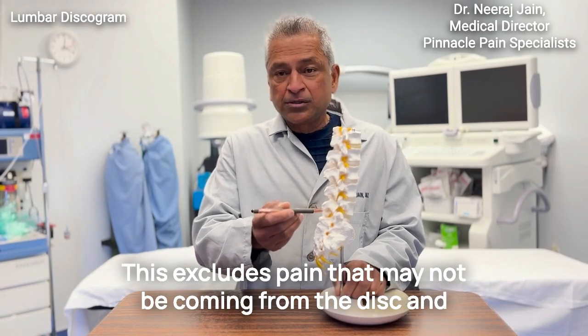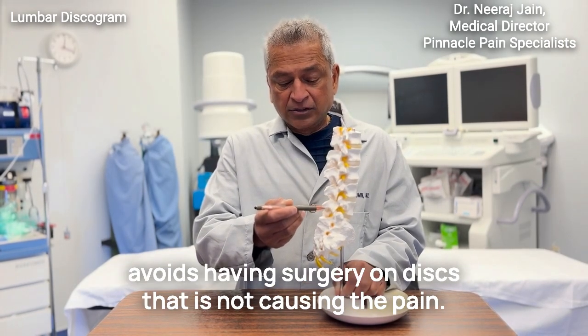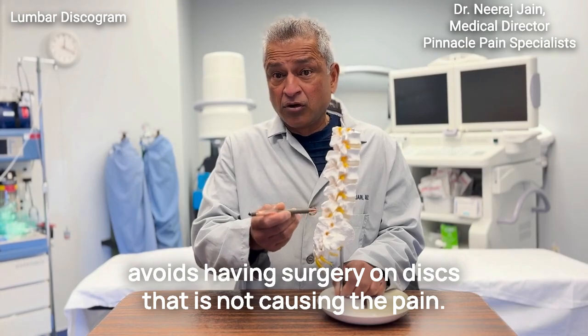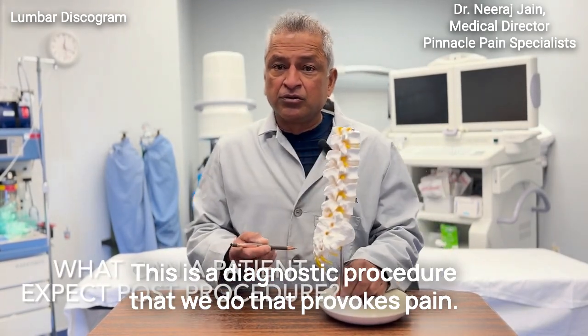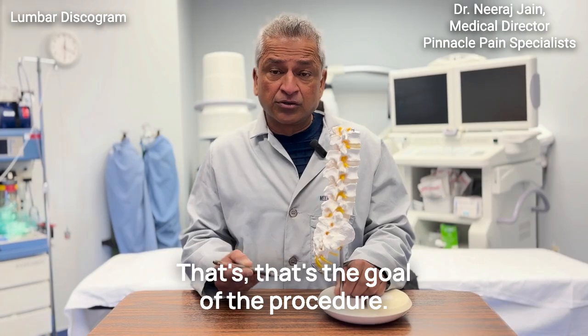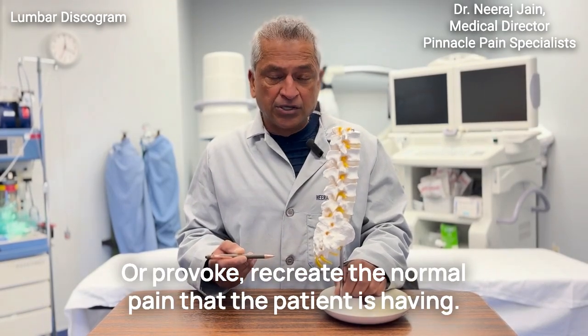This excludes pain that may not be coming from the disc and avoids having surgery on a disc that is not causing the pain. This is a diagnostic procedure that we do that provokes pain. That's the goal of the procedure, to recreate the normal pain that the patient is having.